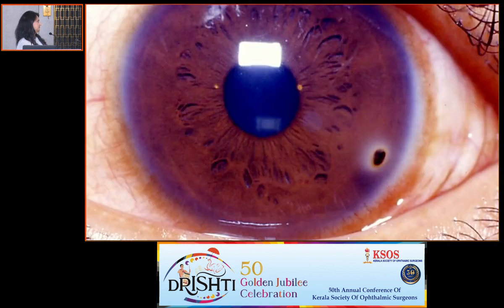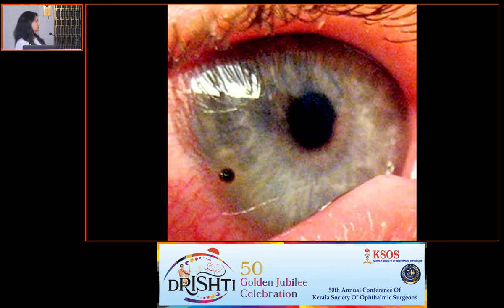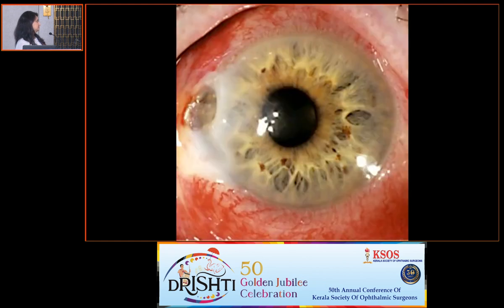Some of the complications of a corneal metallic foreign body are delayed presentation causing leukocytic infiltration, secondary added infection, which could be bacterial or fungal, or a deep foreign body. Extra care has to be taken while removing a limbal foreign body, as the chances of perforation are slightly higher in these areas. And in case of perforation, a contact lens can be placed.